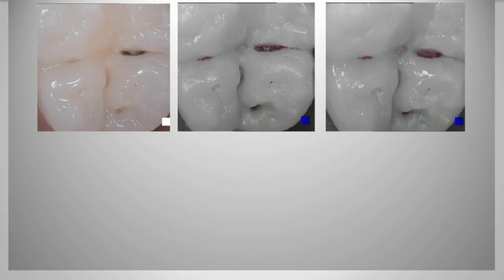And what I mean by that is during your preparation. So let's look at a picture of a tooth in the daylight or the intraoral camera. Anybody can see here, yep, we see that's probably something going on there. So what we do is we put it on caries mode, and we find, in fact, there's a red area there, and there, and there, and there.